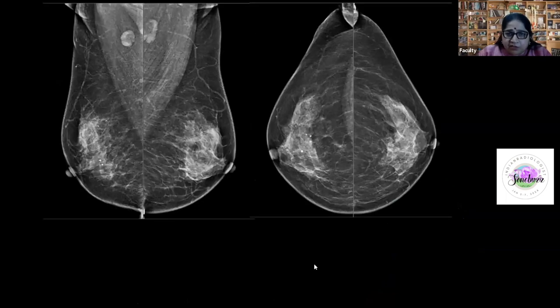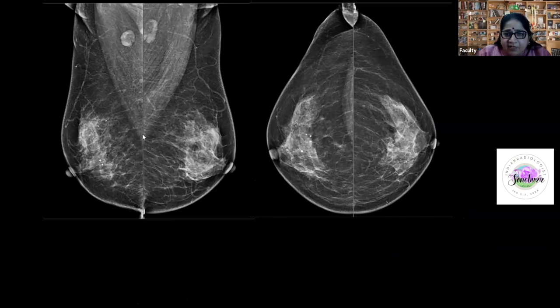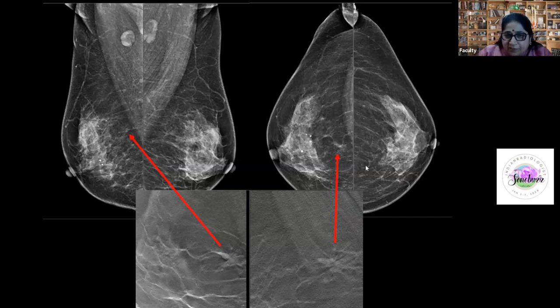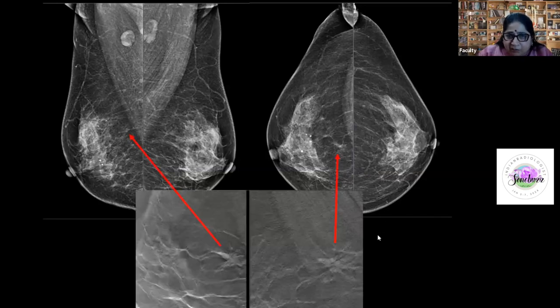Case 1: A 52-year-old female for screening mammogram. The fibroglandular tissue should ebb like the tide away from the nipple, but there is a little bump of focal asymmetry in the retroglandular 'No Man's Land.' On tomosynthesis, it is immediately a spiculated, irregular, suspicious mass. Without tomosynthesis, a spot magnification view and targeted ultrasound of that deep central area will still pick it up. This is a potential pitfall to avoid.